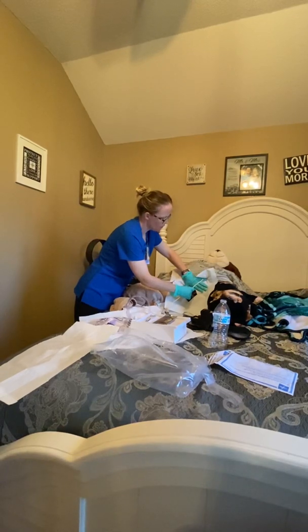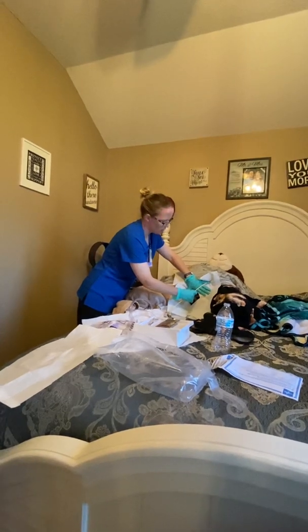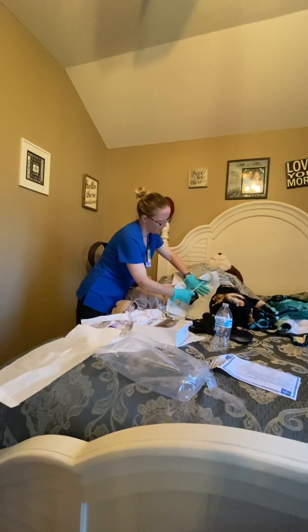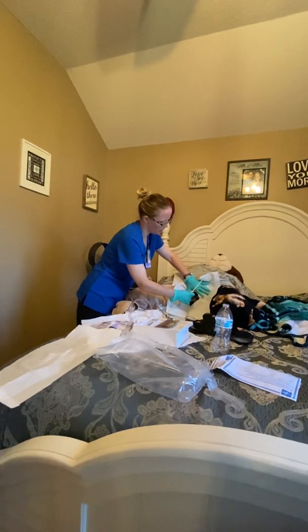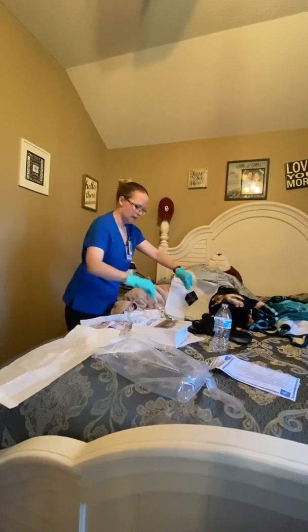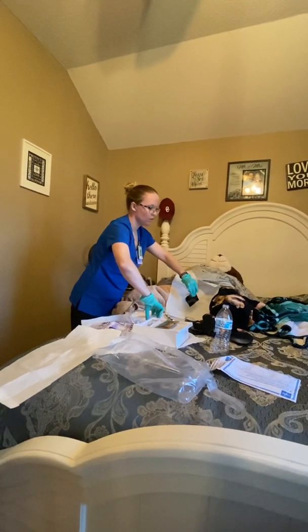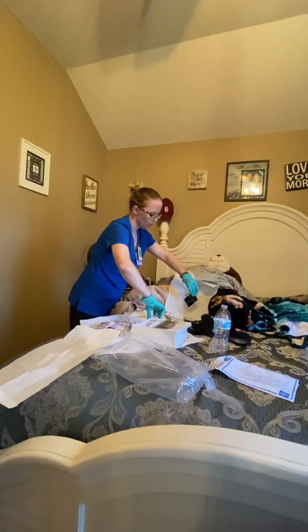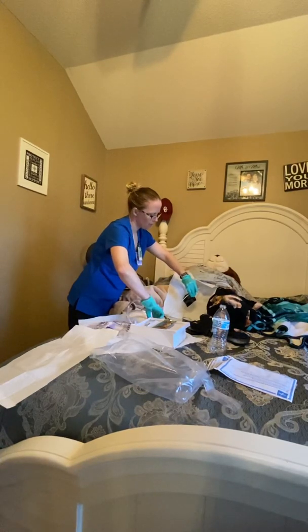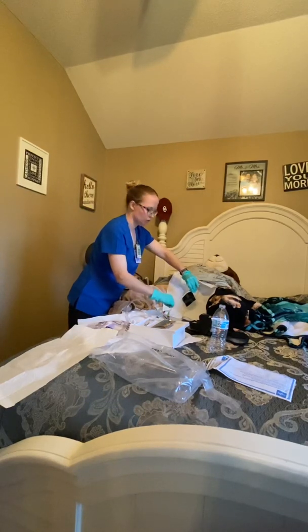Now that it's in, we're going to get the syringe. Since the catheter is in, we're going to take our non-dominant hand that's holding the labia and let it go, and we're going to grab the catheter. We're going to use our dominant hand to insert the fluid from the syringe so the balloon will inflate. Once all that water is inserted, that means the balloon's inflated. You're going to tug on it just a tad bit, just to make sure that it's in there.